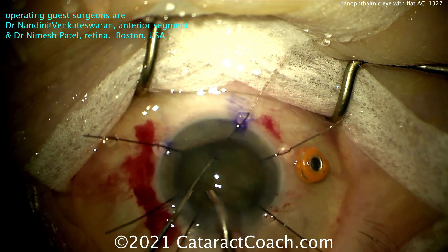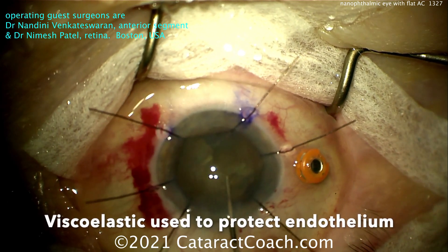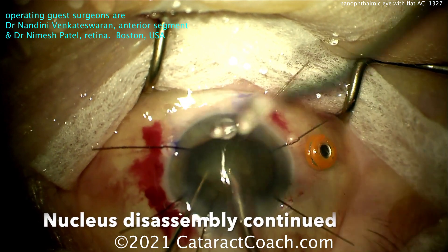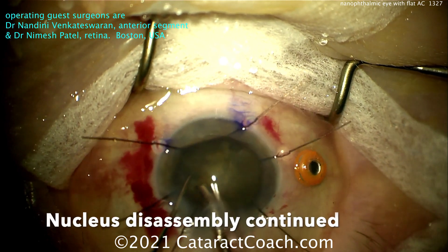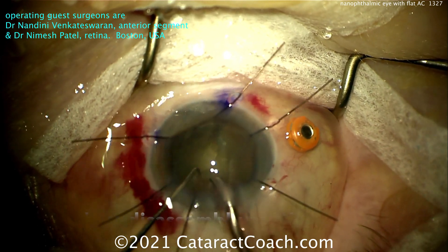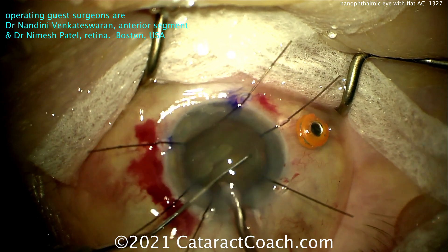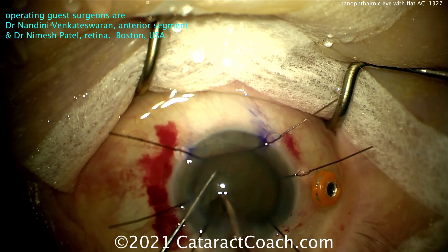The pupil expansion ring adds extra bulk into a very shallow anterior chamber — a small AC. Coating of the endothelium — beautiful, smart move. Now just more nucleus disassembly, slowly but surely, taking these pieces down. The draping is great — with that draping, there are zero eyelashes in the surgical field; that is so important. About half the nucleus is out, and now the remaining half is coming. I like the idea of leaving that trocar in the eye as well, in case you need to access something else.